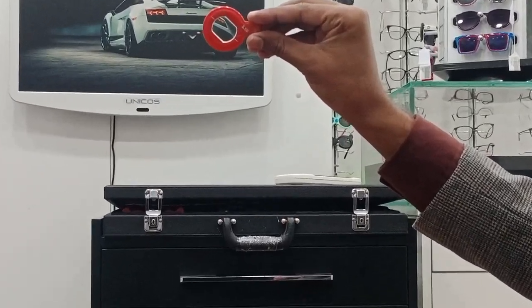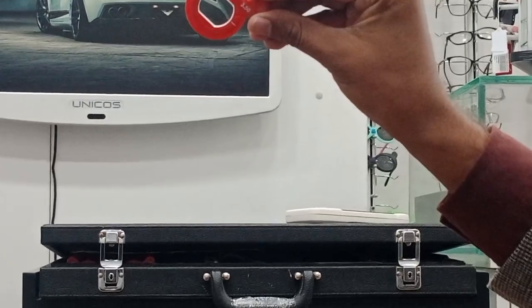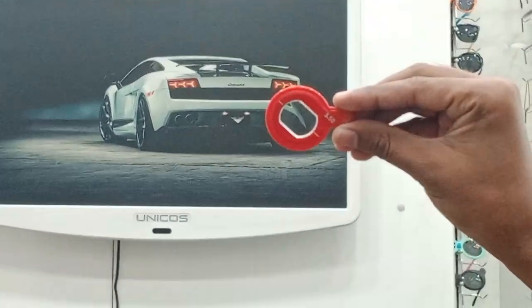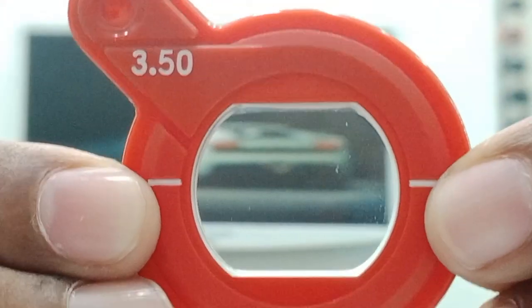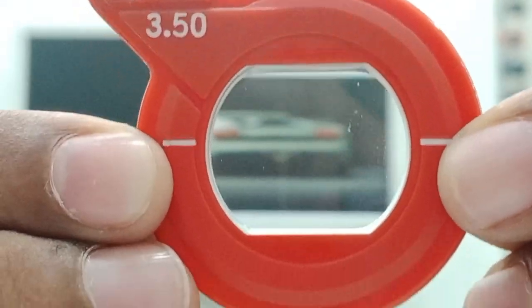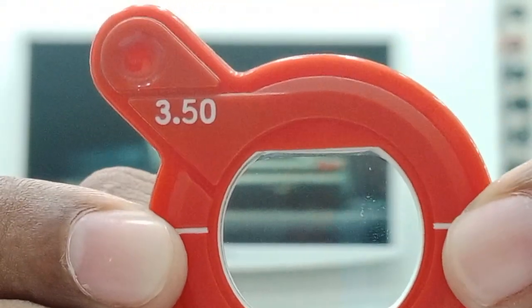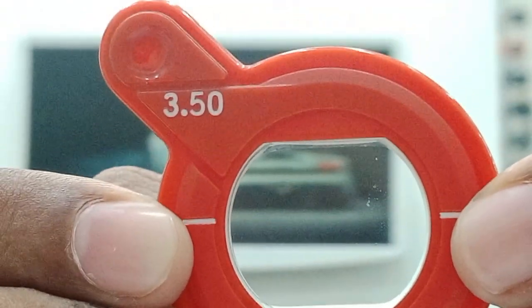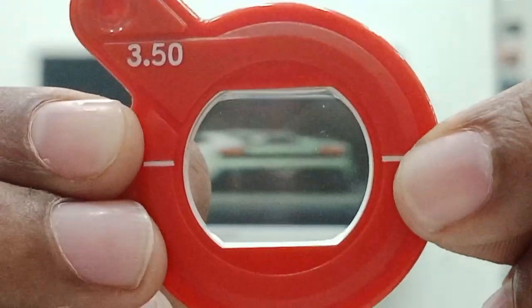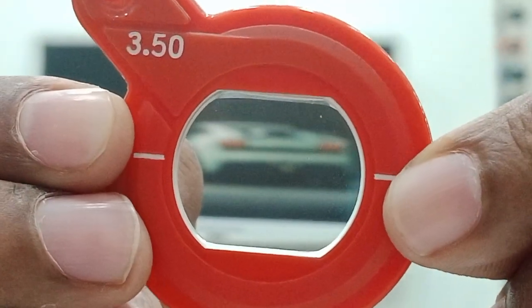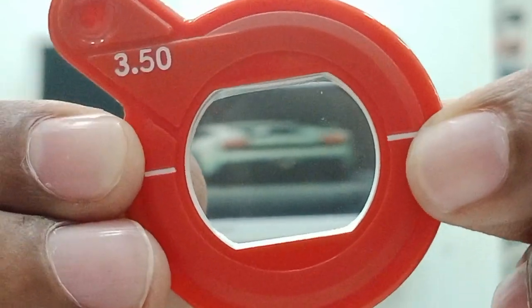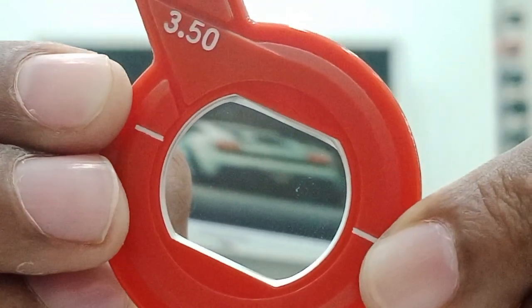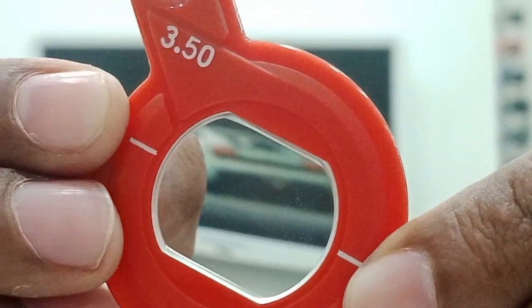This is the minus cylindrical lens — shown in red. As you know, if the lens is minus, there should be with movement, and the car and the lens are moving in the same direction. When I rotate the lens, the car also moves in the same rotational direction, confirming this is a minus cylindrical lens.